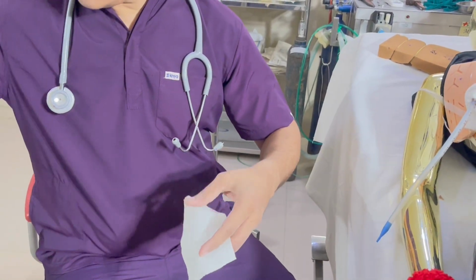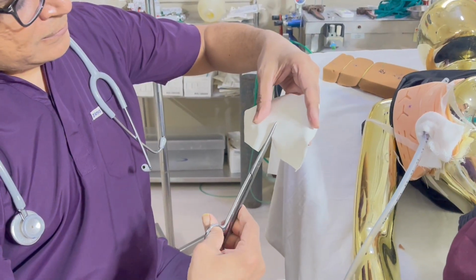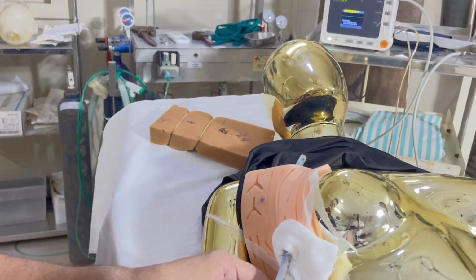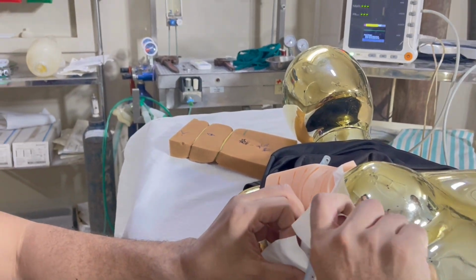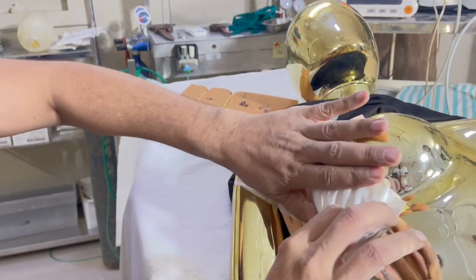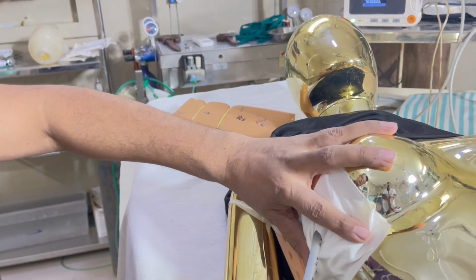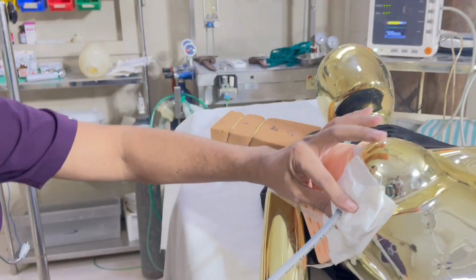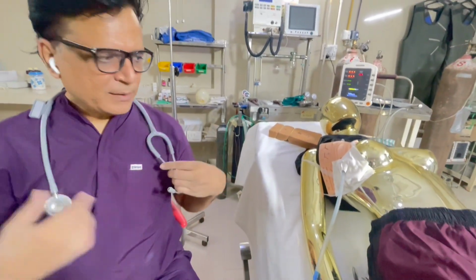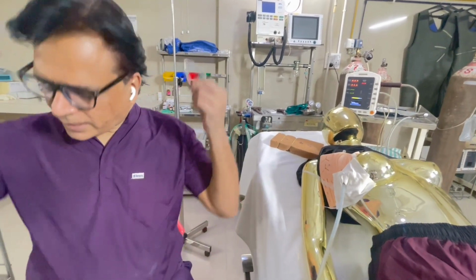In such a manner that, so this is secured. So this drain will be completely secured in the chest. So when the patient is doing movements, this is not coming out. So once this is completed, you have to confirm this by doing the chest X-ray.